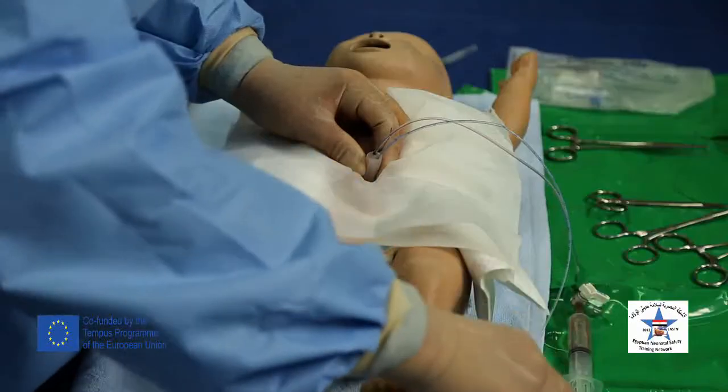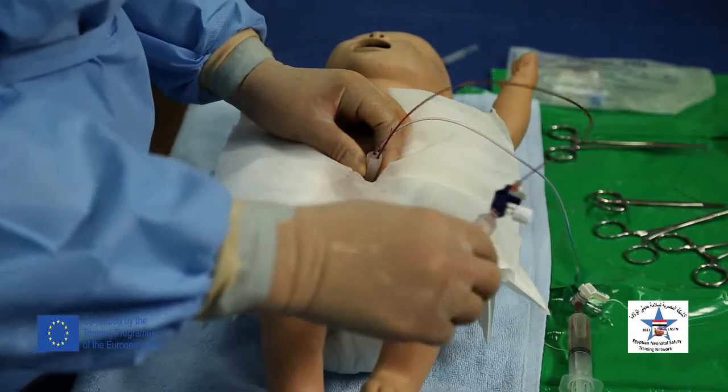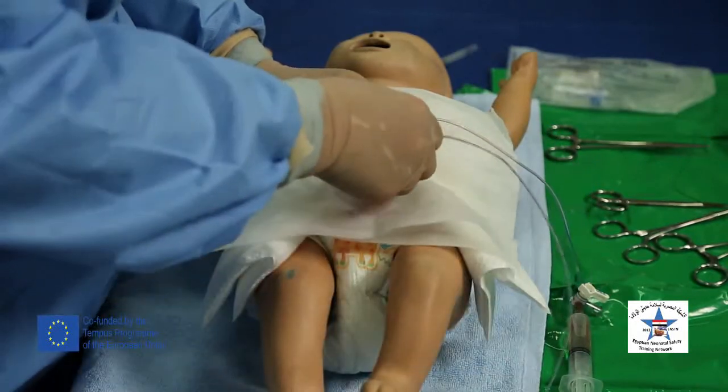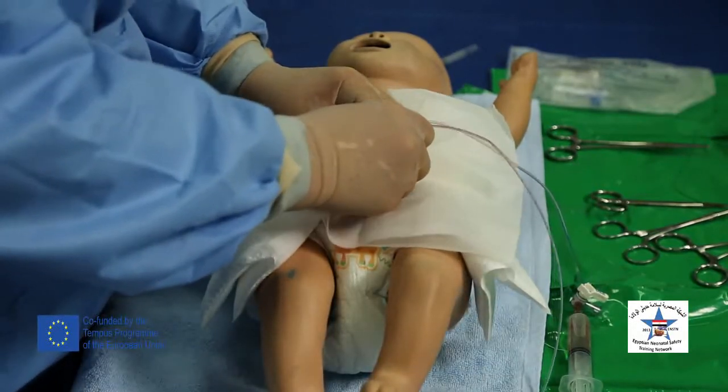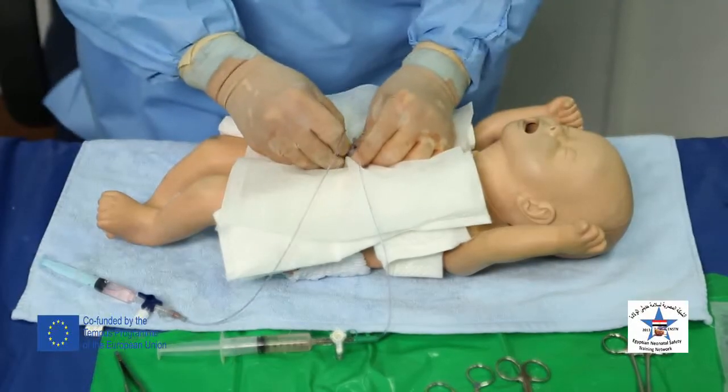centimeters, and then try to withdraw blood. If blood is withdrawn, that means that we are in the right space. So continue insertion of the umbilical arterial catheter to the predetermined length.